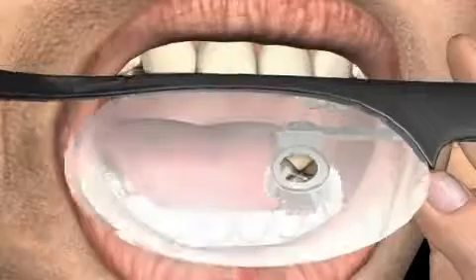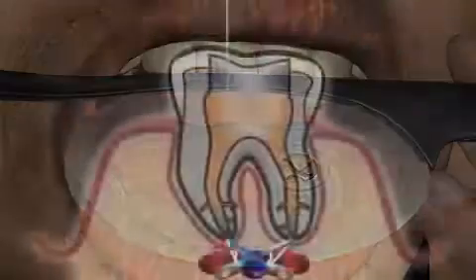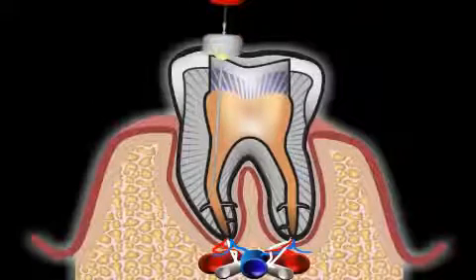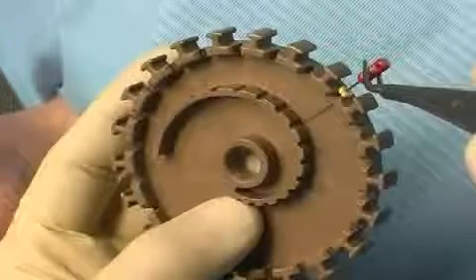The dental canal must be fully reconditioned all the way to the root end. The length of the root is ascertained by means of X-rays and measuring aids, as can be seen in this image. Only a well-reconditioned tooth filled all the way down to the root end can be preserved permanently.